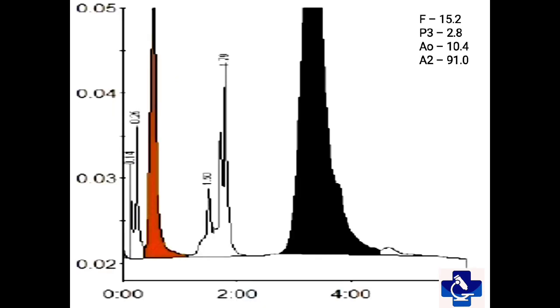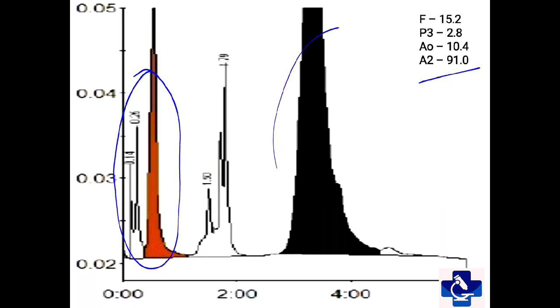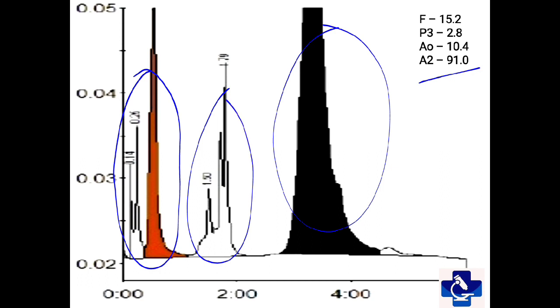In this case, fetal hemoglobin is around 15.2%. A2 forms the major fraction at around 91%, but we also have A0 of around 10.4%. So this is likely a case of HbE and beta-plus thalassemia, as there is synthesis of some A0. Also, the differential diagnosis can be an HbE homozygous patient having had a recent blood transfusion.